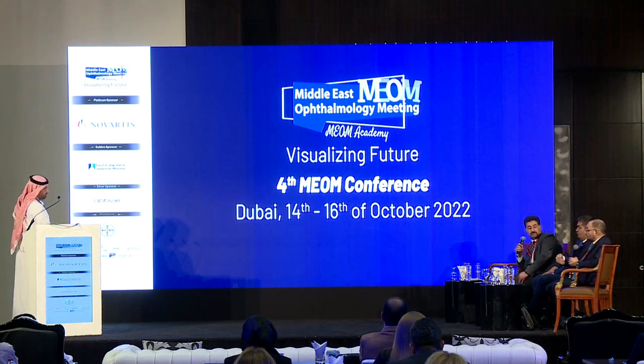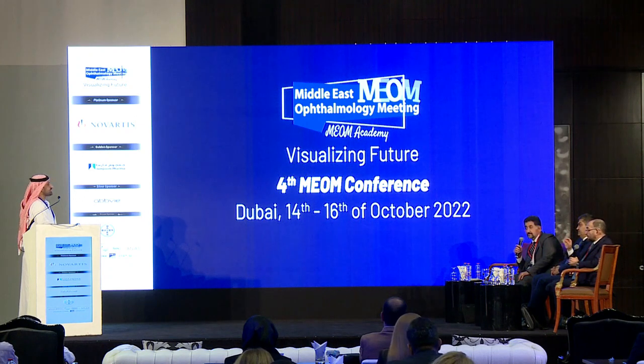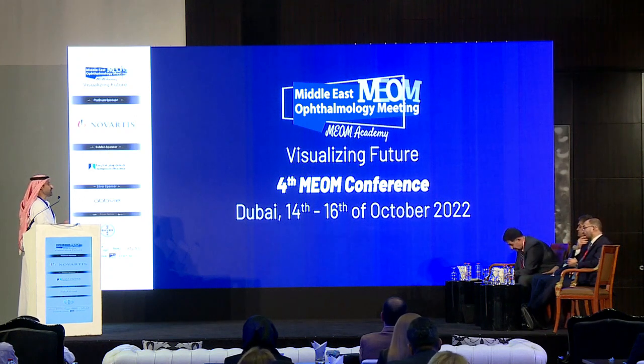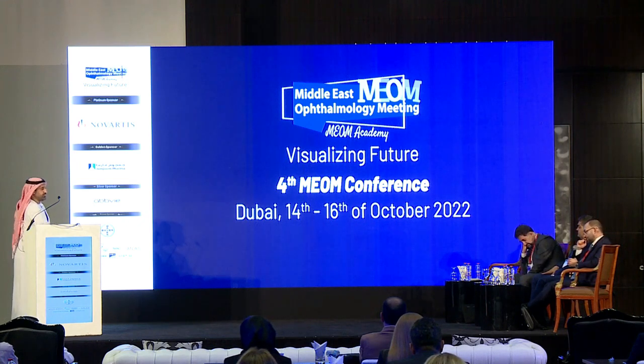In my opinion, we have a record on an Excel sheet showing all the data from the start to the end. Whatever it is at that time, I'll do cross-linking. If the patient is progressing, I'll do cross-linking again. So I did, and what I aimed for was flattening. Well, flattening is expected in some.